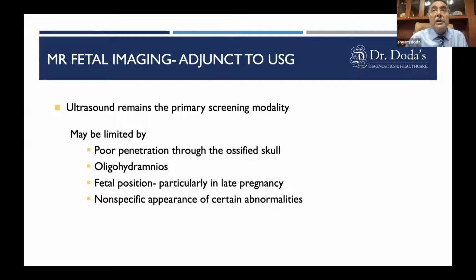In imaging, in every modality, sometimes you want to be a little more confident. Sometimes you are not very comfortable, and you want the help of another imaging modality. And that we usually do in other types of cases also.